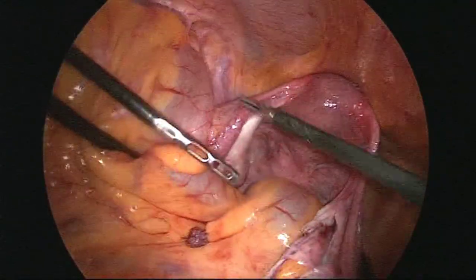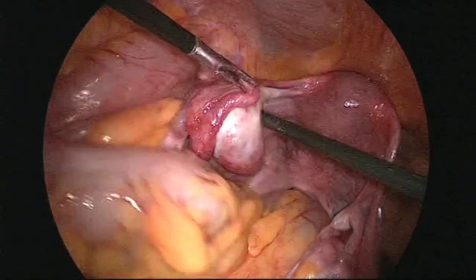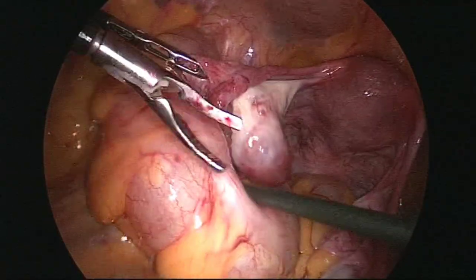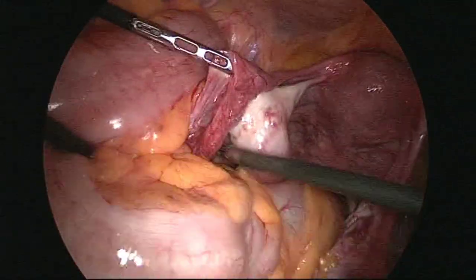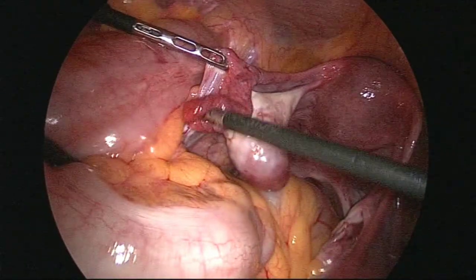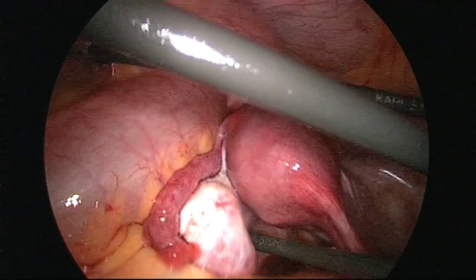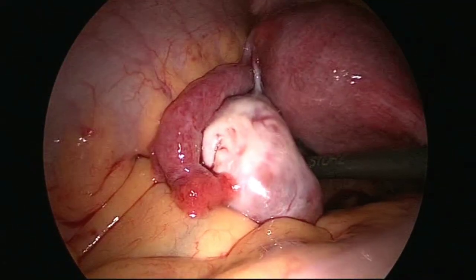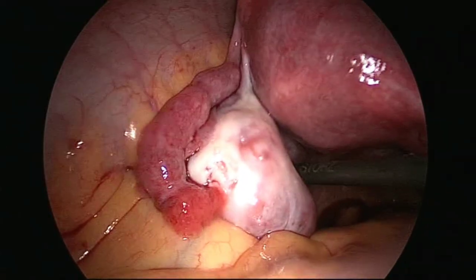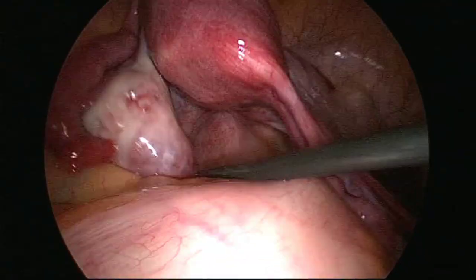Now coming to the other side. This is the left ovary, looking healthy, and we'll check the tube as well. After that we'll do CPT, chromopertubation test. Now my vaginal attendant will push the dye and we'll see whether there is free spill or not. Left side tube we are doing CPT now. Pushing, yes, you can see dye is coming, so the left tube is patent.